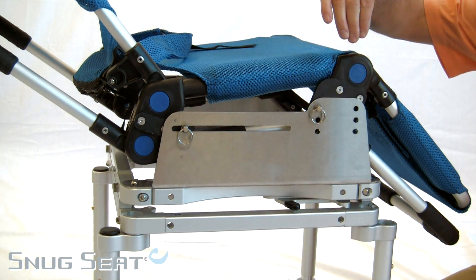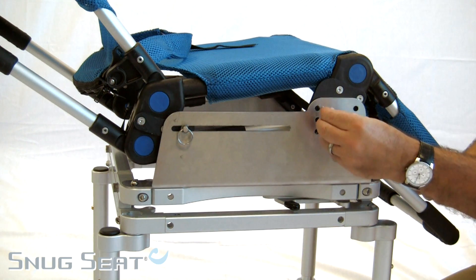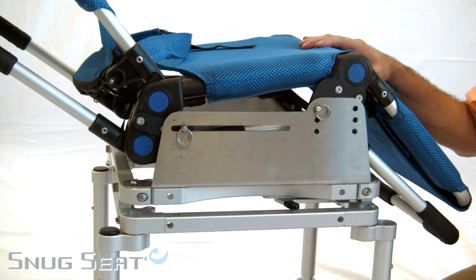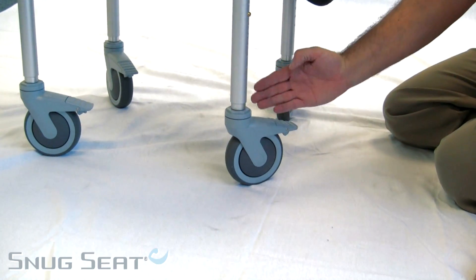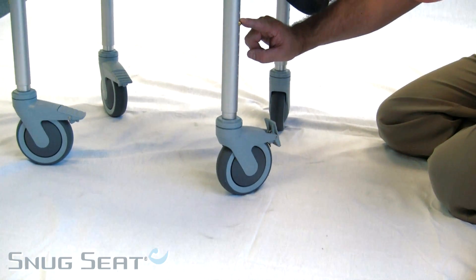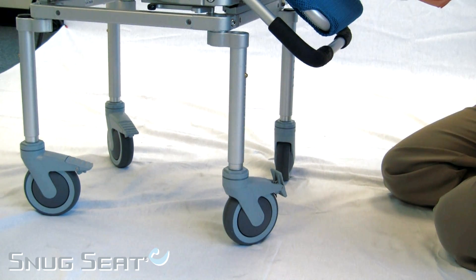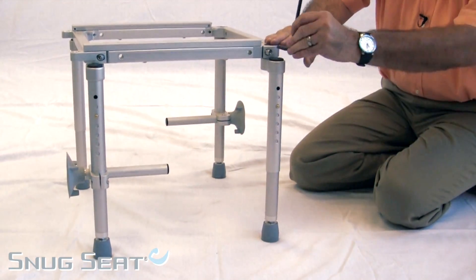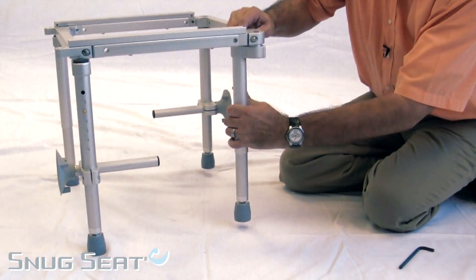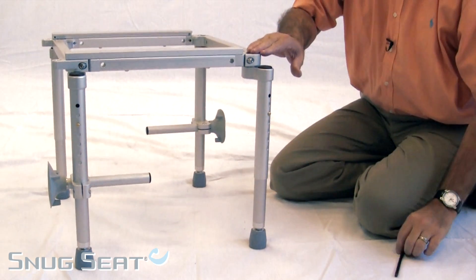The tub slider has multiple holes and placements for depth and angle adjustment within the frame. By simply pulling the pin and selecting the proper location, it allows you to fine tune your adjustment for either your child or the bathroom configuration. Each wheel comes with a lock that allows for stable placement, and each leg has height adjustment. The tub base allows for adjustment in width by a rotational leg, for either placement interior or exterior to the frame.